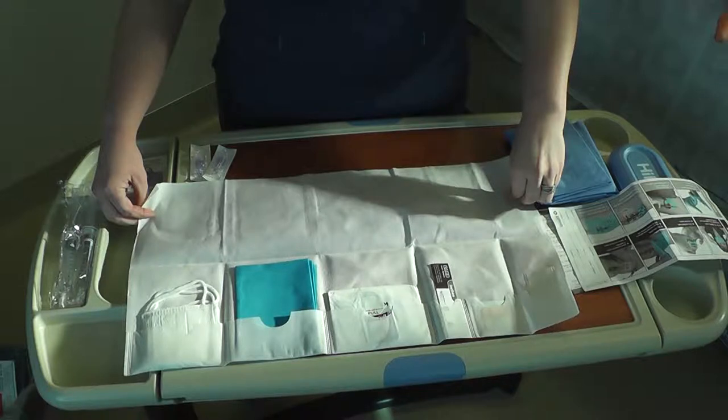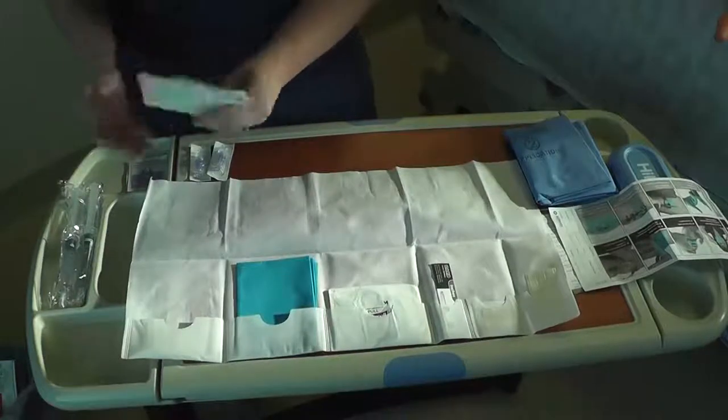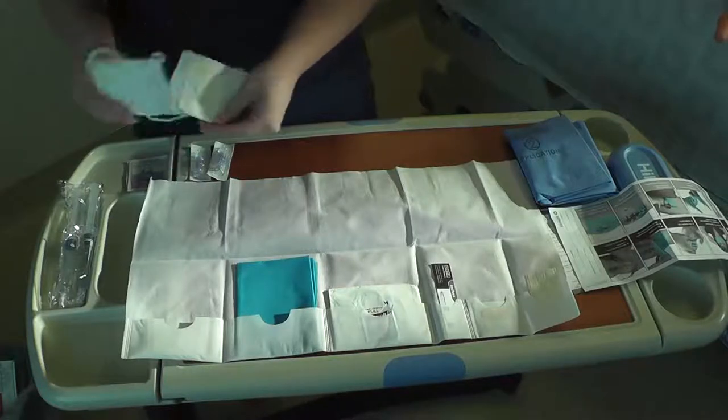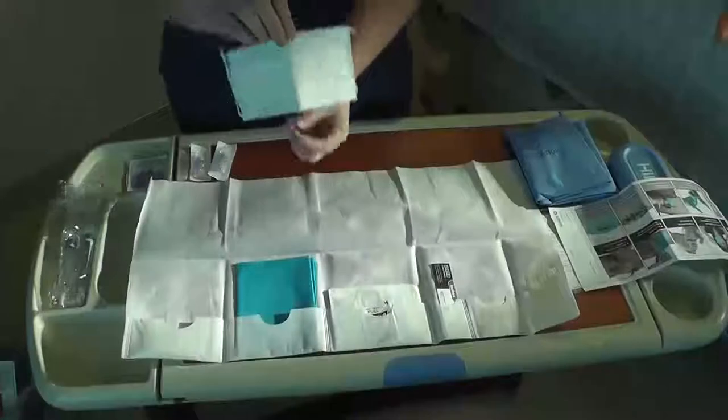All supplies are to be used for the correct procedure. Avoiding use of any supply is a choice to perform the procedure incorrectly. Two masks are available — one for yourself and one for the patient.